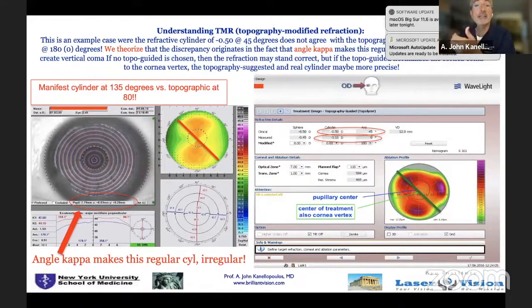So by breaking down the data, and this is very technical, we're seeing here on the Contura platform the refraction of this patient, which only has half a diopter of astigmatism, where the measured refraction by the device points out 1 diopter of astigmatism on a different axis. So the axis of the refraction is a red diametric line on our left image, where we can clearly see that the corneal topography shows a with-the-rule, almost 90-degree topographic astigmatism in this patient. And this is puzzling. Why is it that the patient consistently gives us a different refraction?